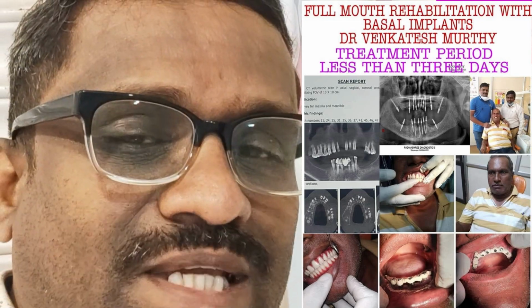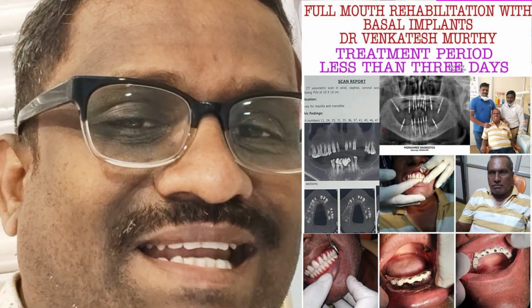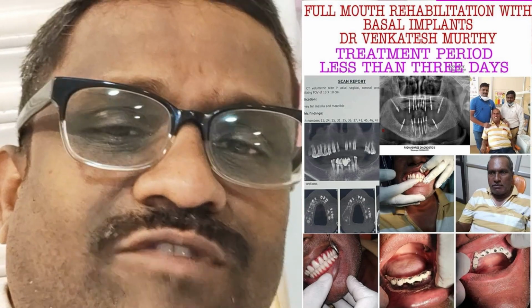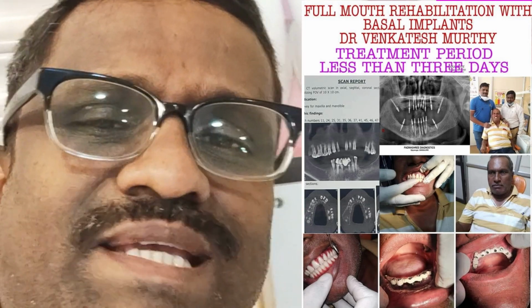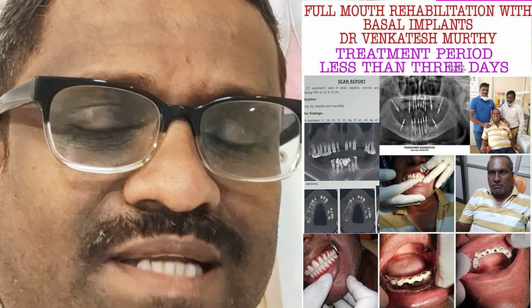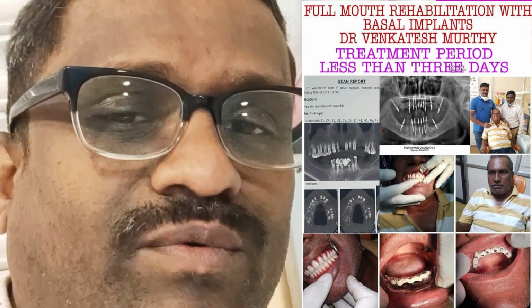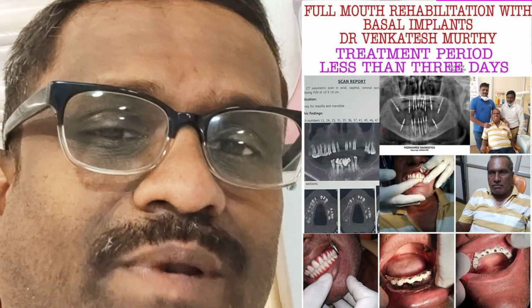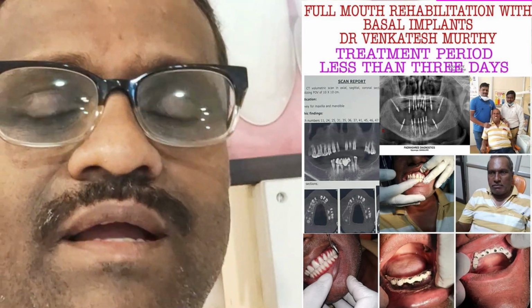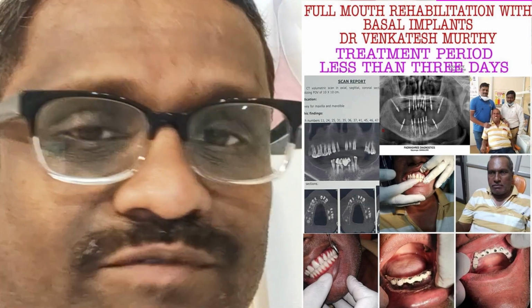Coming to the upper posterior maxillary region, wherein the presence of the maxillary sinus, you have to carefully place the implant in the molar area. If the bone is good, of 8 to 10, BCS small screws of 10 or 12 you can place in the molars. If the floor is very close to the crest, where you cannot place the implant of bigger length, you can place the implants anterior to that, that is in the anterior wall of the maxillary sinus and in the posterior wall of the maxillary sinus.